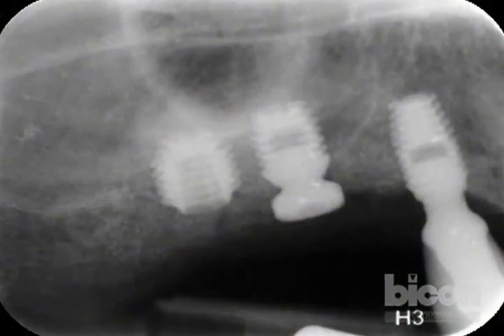Well, the Bicon design is for an intracrestal placement. The sloping shoulder of the implants are designed specifically to be within the crest. It doesn't affect the healing and the integration, but it will affect the aesthetics of the case. As you can look at the case, actually the implant immediately to the mesial of the two that I've just placed, you will see that a part of it on the distal, the shoulder, is not actually within the bone, and it doesn't affect its longevity and integration. However, the only way to make it look aesthetic is with an integrated abutment crown.